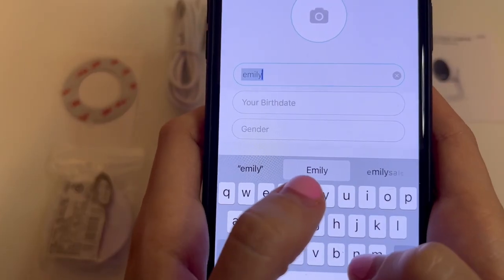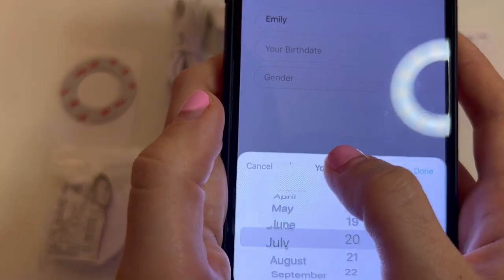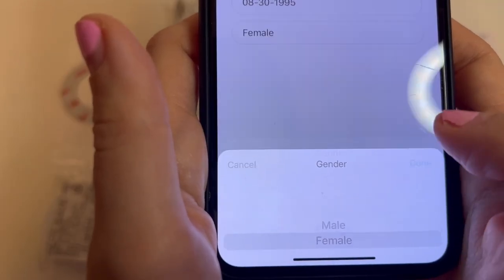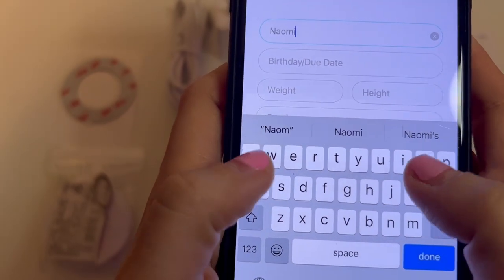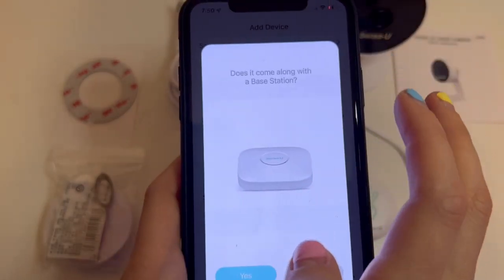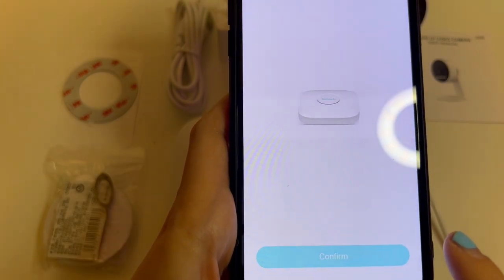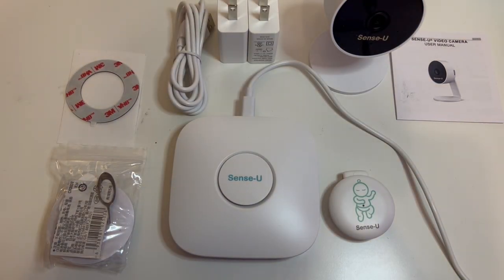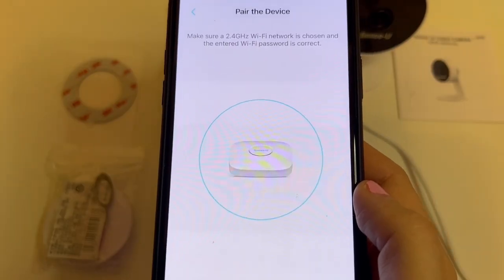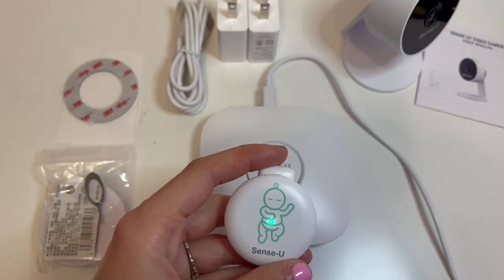I then downloaded the app and began registering. It asked me things like my email, my name, my birthday, and my gender. After I was done with that, it asked me some stuff about my child — like her name, her birth date, her height and weight, and her gender. I then went ahead and started adding the device. I clicked Naomi and started adding her base station to the app. You can see all these lights flashing, and then eventually it was added to my profile, and then I went ahead and paired the baby monitor.